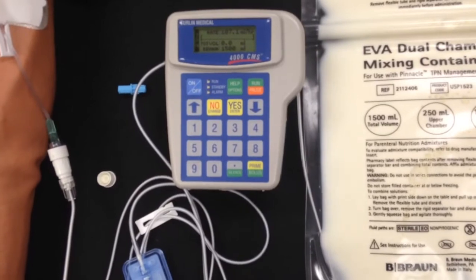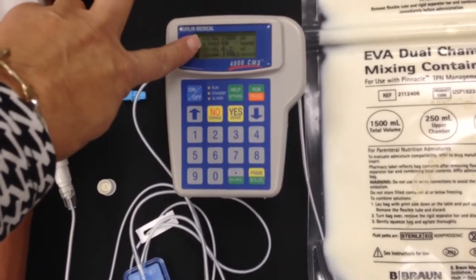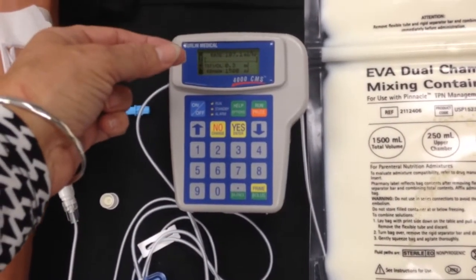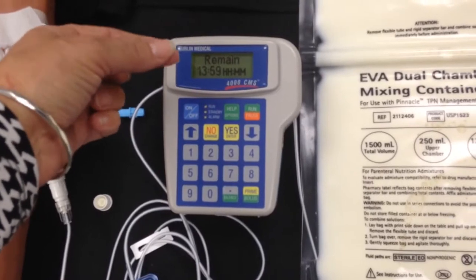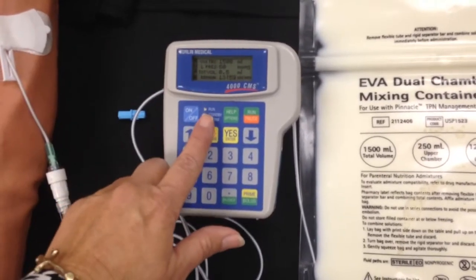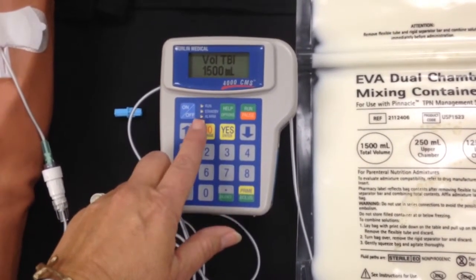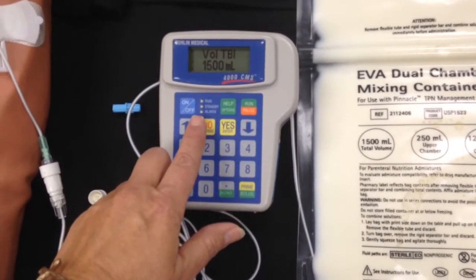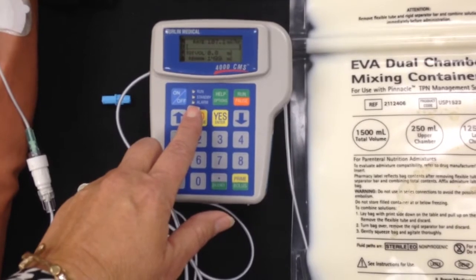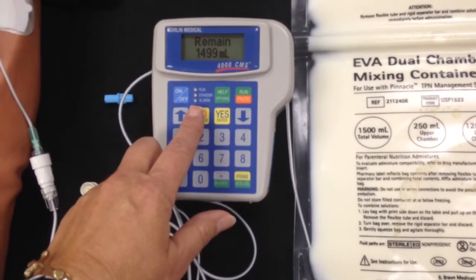When the pump starts, you can hear it. You can also see the information that's on the pump, like how long is remaining of your infusion and some other information, pop up big. That will tell you that it is running. Also, the green button next to run should be flashing. If the yellow button next to standby or the red button next to alarm are flashing, or the pump is making a beeping noise, it is not running. Please call the pharmacy for further instructions.